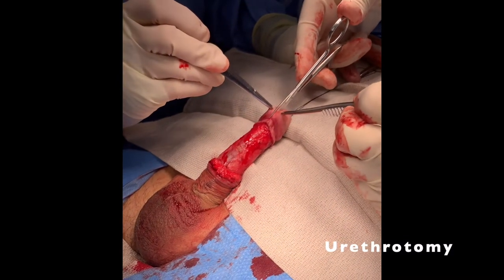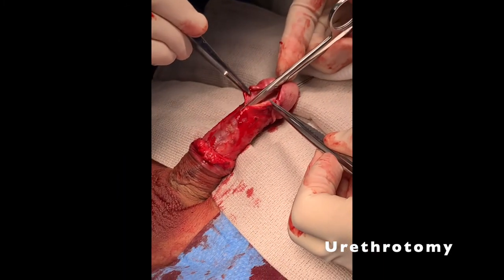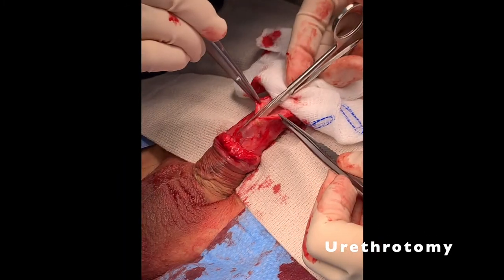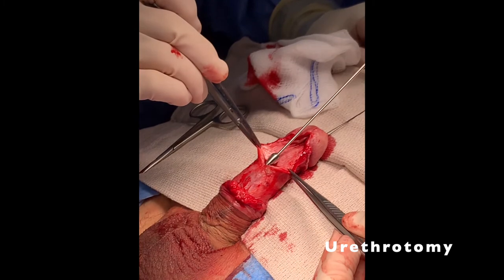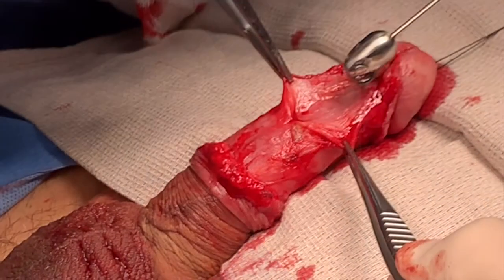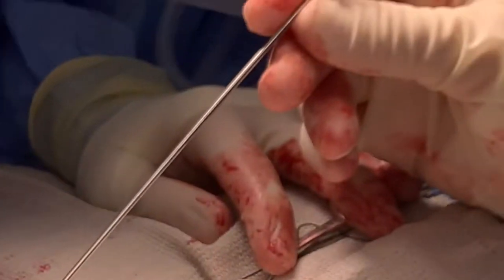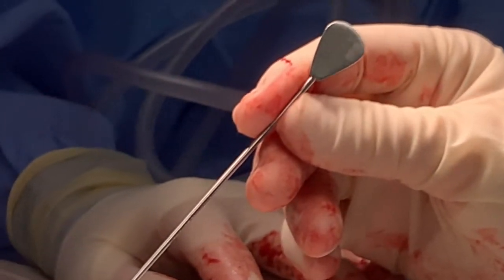We then made a ventral urethrotomy from the meatus through the glans until we noticed normal urethromucosal lining. This was calibrated with bougie dilators and was able to accommodate up to 32 French. Cystourethroscopy was performed. No further strictures were noted.